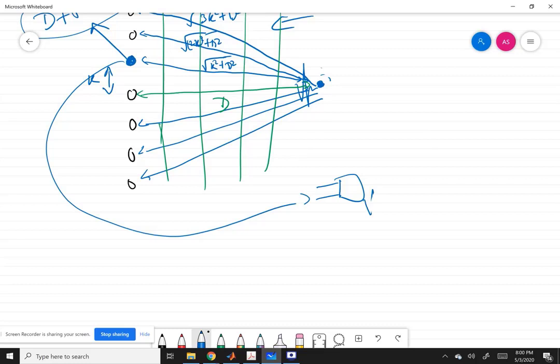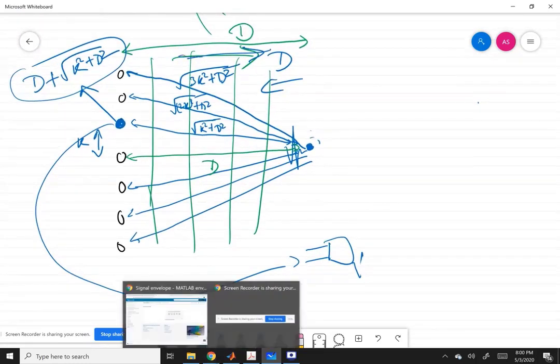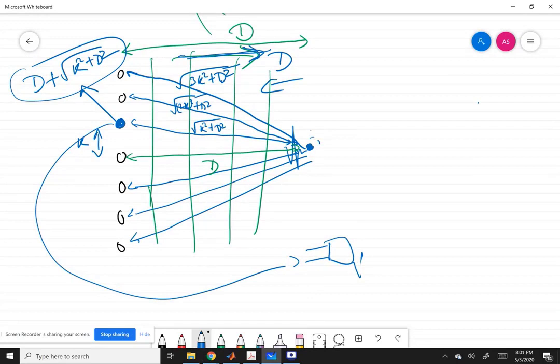So all the transducers have the same path length in the forward path, but while coming back we are calculating the time of flight of the wave which originated from the point of observation, not from the transducer, so that path length becomes different.